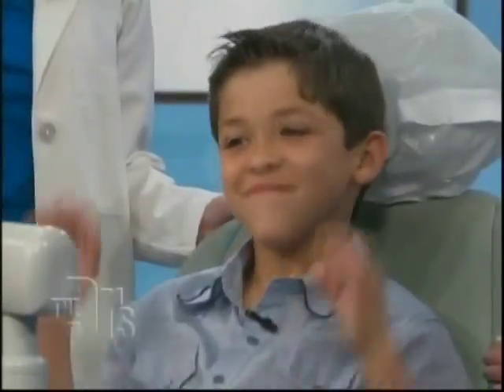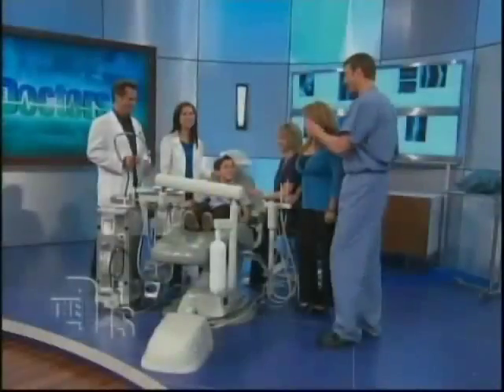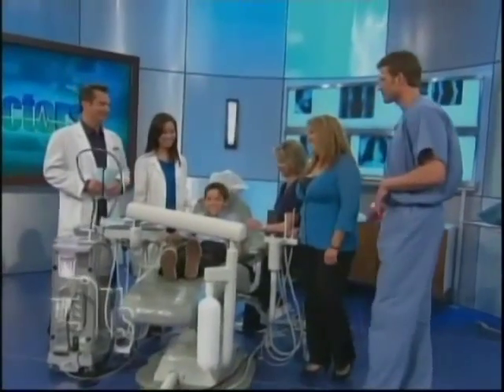We have Dr. Christina Doe here. She's a pediatric dentist. She's here with her patient, 8-year-old Zach, and Melinda. Zach, you have no fear, right, buddy? Zach's an animal.